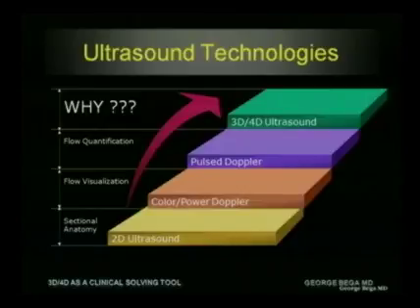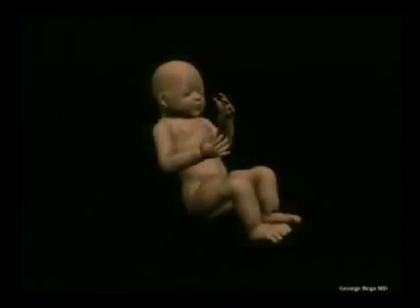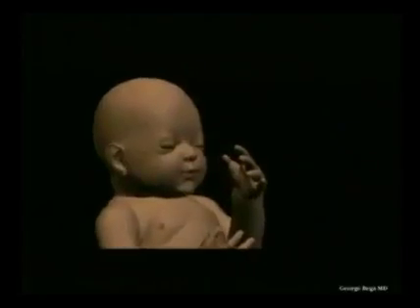But the fact is there is really no clear understanding of this technology. There is no clear picture here as to why we would need this new technology. What do we normally do with 2D ultrasound? Well, typically we get the normal standard planes. We're all taught to get these standard planes.